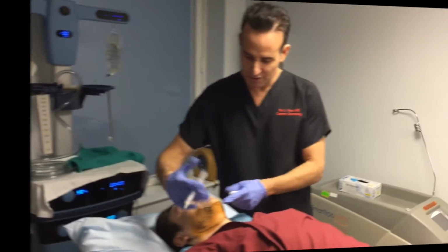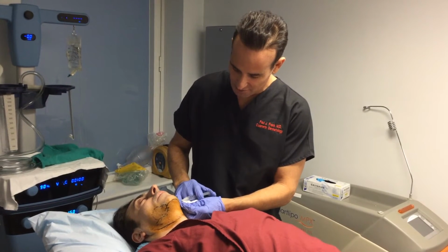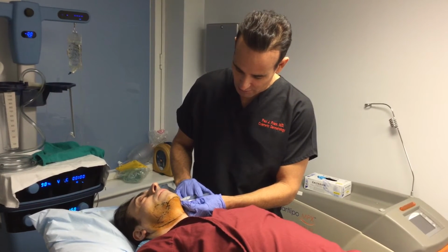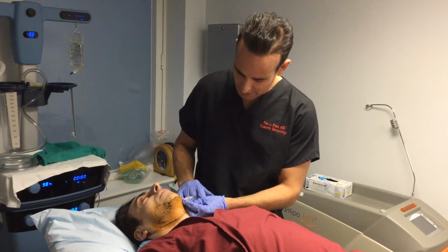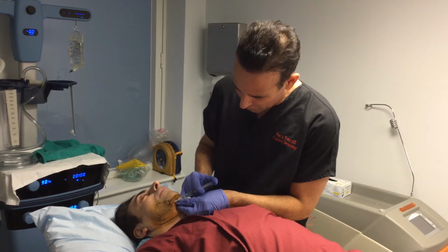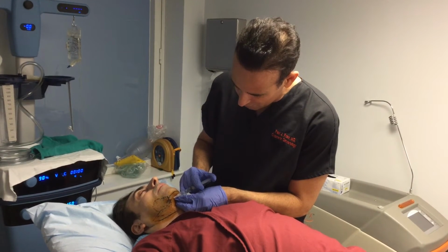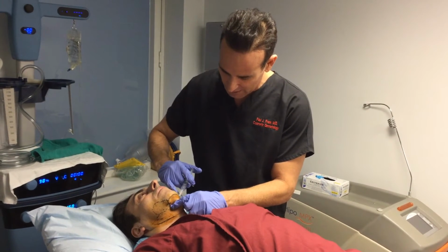Okay, so we're going to put in some local anesthesia now. Again, we're playing dentist here. He's totally sterilized. He's drawn out. I'm going to put in two little blebs right here. Hopefully he won't jump or punch me. This is the only quote-unquote tough part of the procedure. I've got to get him comfortable and get the area numb. So I will make these two little incisions in a little bit.